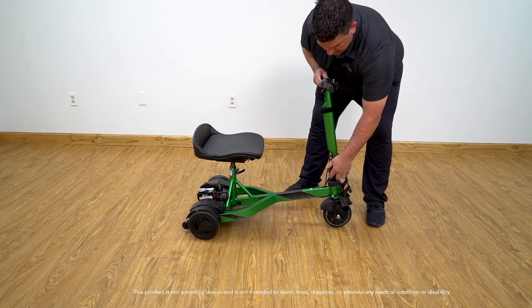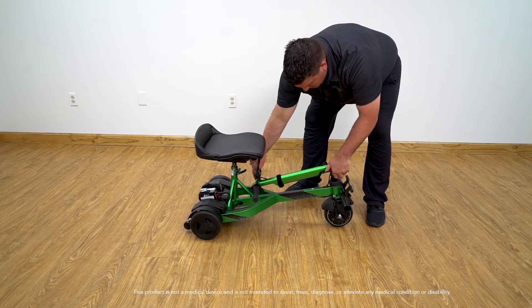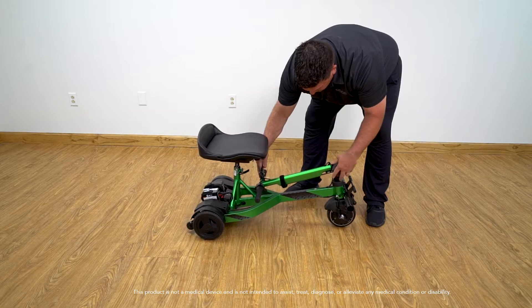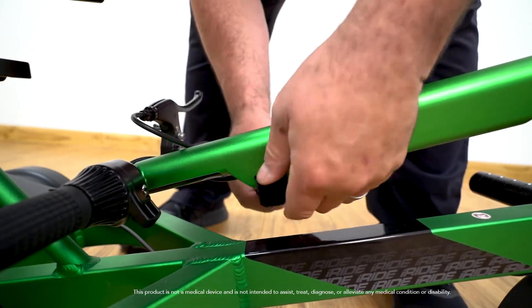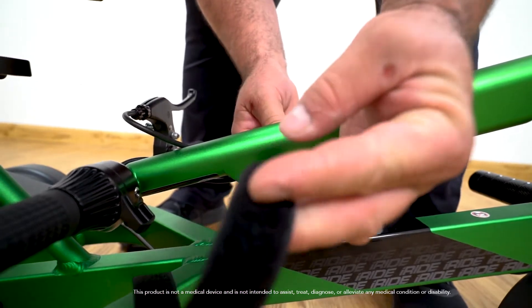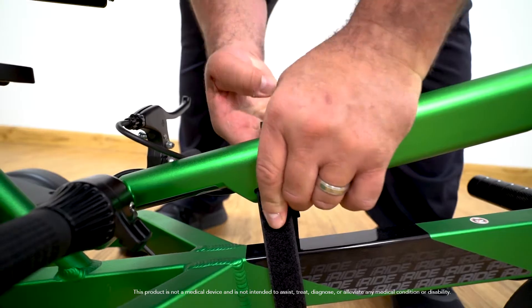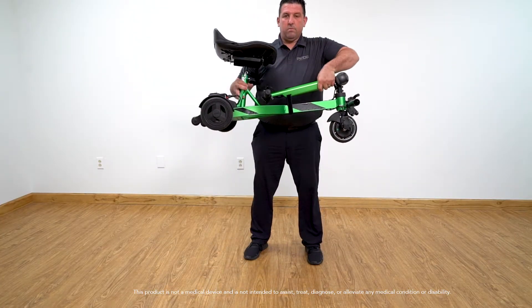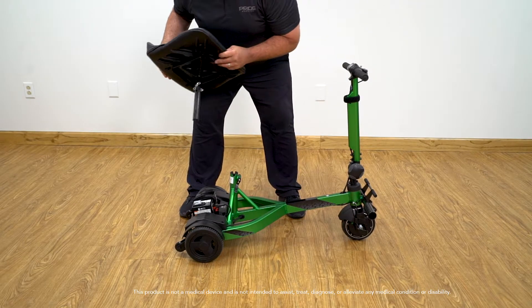With a total weight of 47 pounds, transporting the iRide is very convenient. The iRide has two options for transportation. Option one: you can leave the seat and batteries on the unit and simply fold down the tiller. Or option two: you can remove the seat and batteries to make the unit lighter and easier for transport, as shown here.